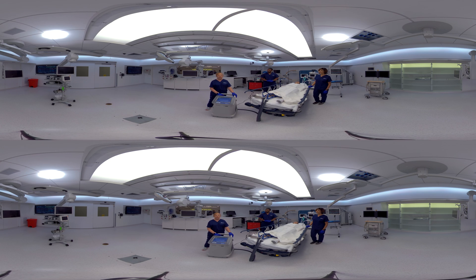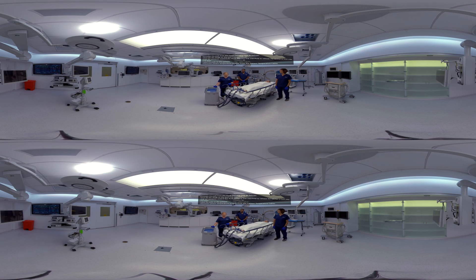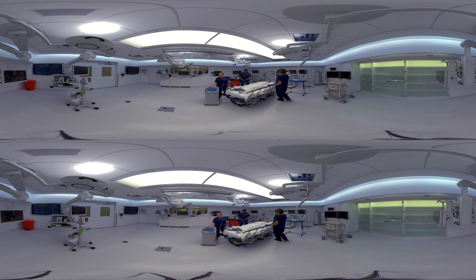Now it is time to transfer our patient from the ER to the ICU. Anytime you are going to disconnect the Arctic gel pads from the Arctic Sun 5000, you first need to click stop. You will hear that therapy has stopped and you will be prompted to click the start button in order to return all the water from the gel pads back to the device. This process takes about 45 seconds and is very important to avoid letting water leak all over the floor or on your patient. Once the process is finished, we will be able to disconnect the gel pads from the fluid delivery line. Now that the pads are empty, squeeze the clear tabs, push in until you hear a click, and then pull them apart — squeeze, push, then pull. Now we can power off the device and get it ready for transport.